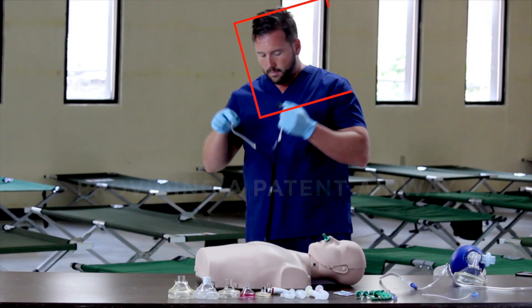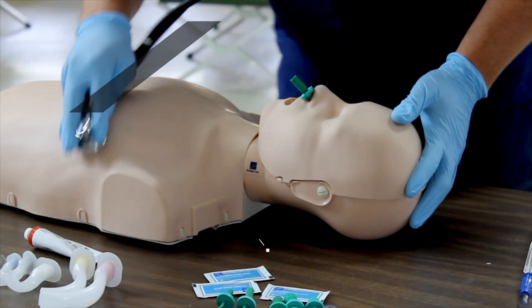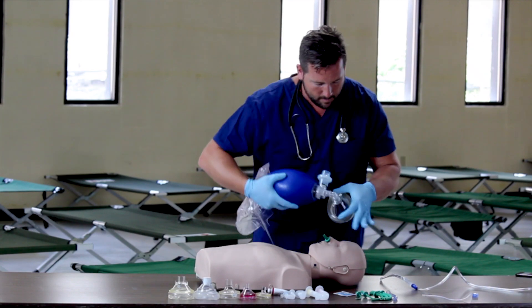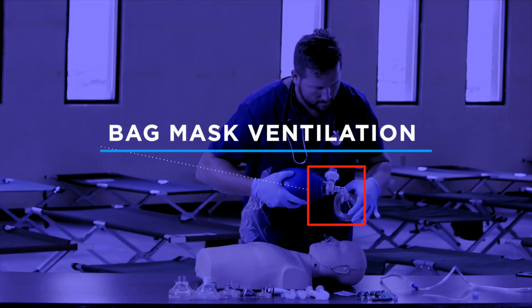After placement, listen to the chest to ensure that the patient is receiving adequate breath sounds. Now that we have our airway adjunct in place, we move to bag mask ventilation.